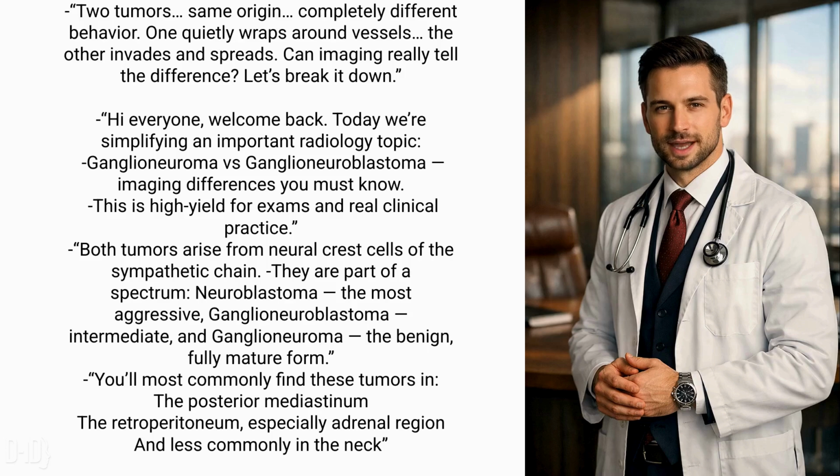Two tumors, same origin, completely different behavior. One quietly wraps around vessels, the other invades and spreads. Can imaging really tell the difference?